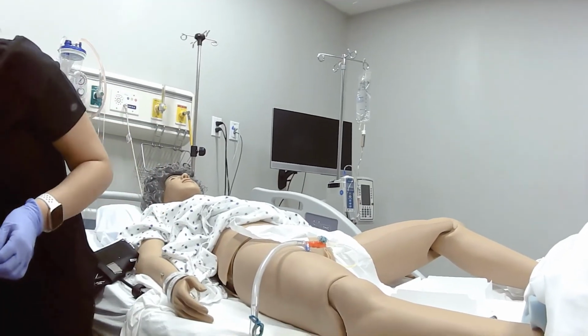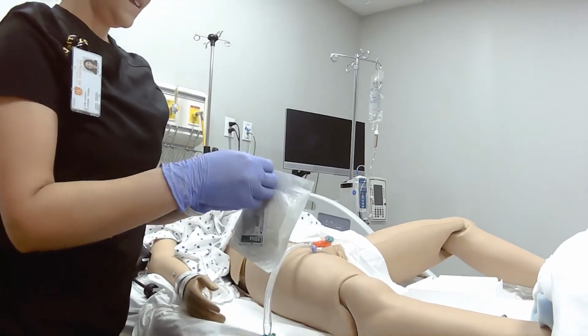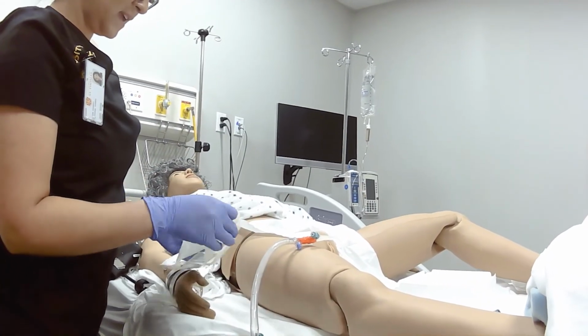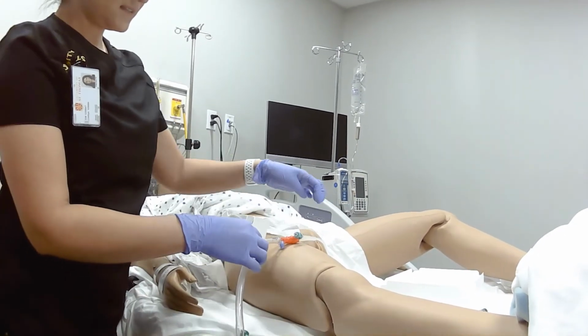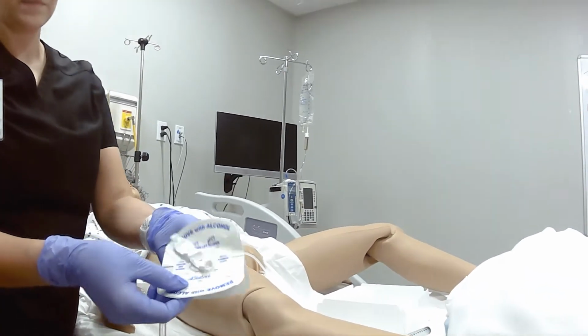And we're also going to attach our stat lock, and you want to make sure that the stat lock is placed carefully, so that it doesn't tug on the urethra, okay?